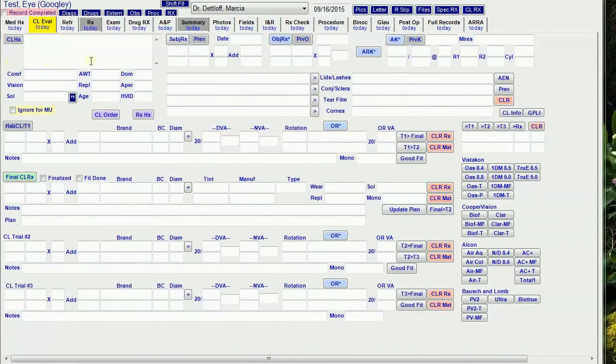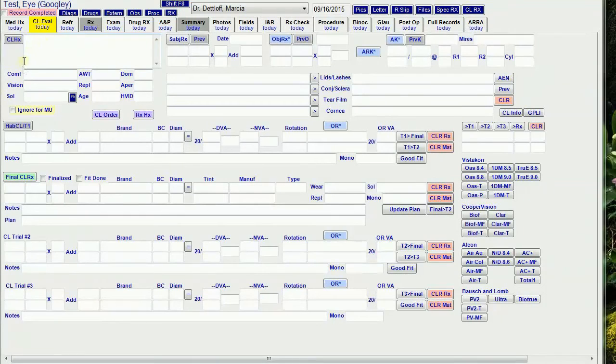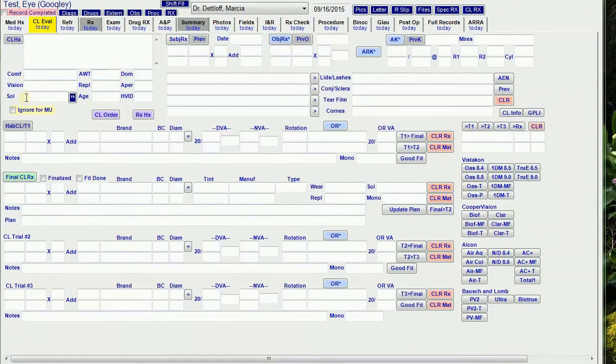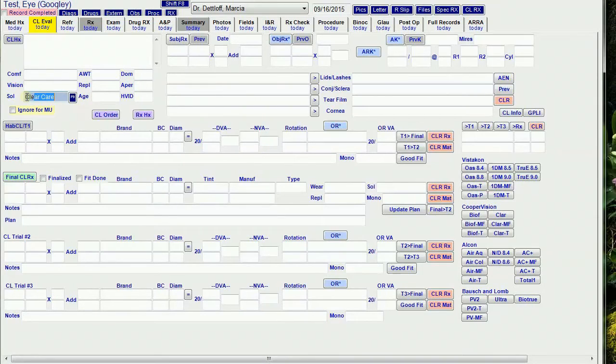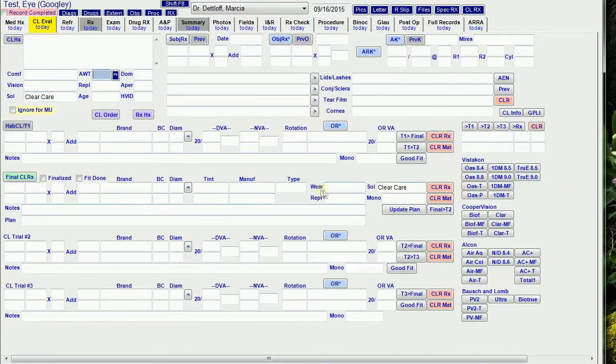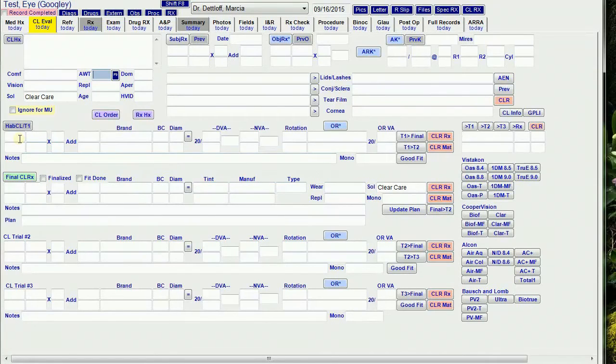Next up is the Contact Lens tab. If this is a new patient, I fill out the Contact Lens History portion here. The Solution field is linked to the final RX solution. So I have to overwrite that if I want to change it. Then I enter their habitual RX or their first trials here.